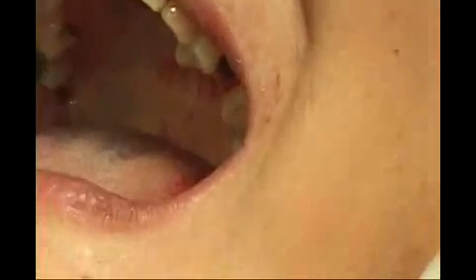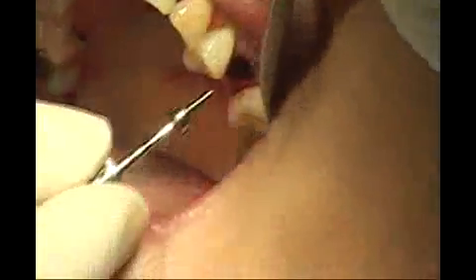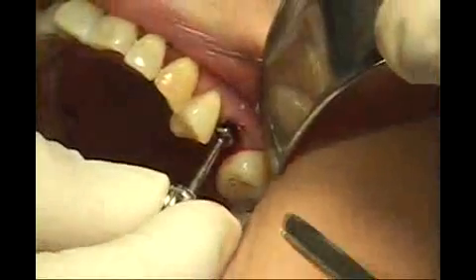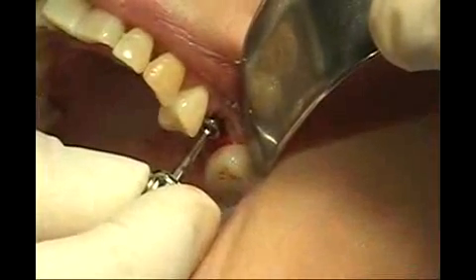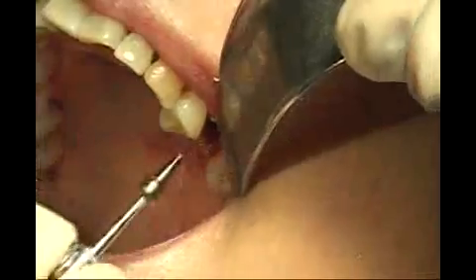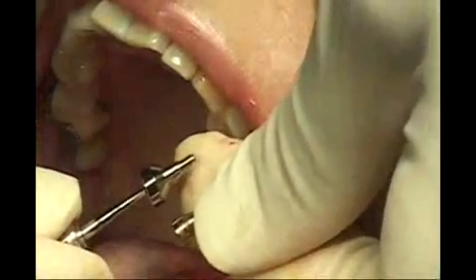So we'll take the healing abutment, in this case a 3 millimeter healing abutment, and place it in the mouth and check. And we notice that there's a little bit of a gap on the buccal. So what we'll do is we'll start using a more flared healing abutment. Okay, so you can see the difference between the two healing abutment flares.